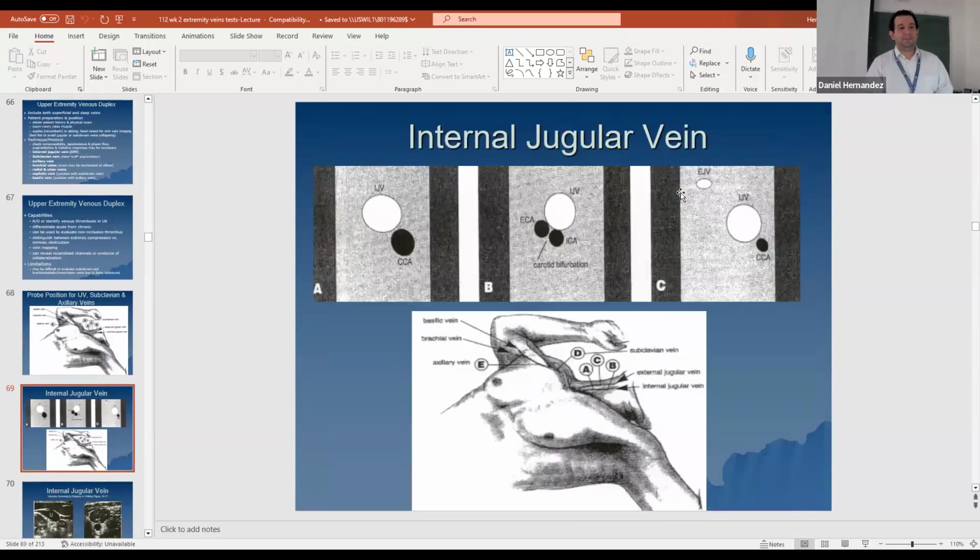So our jugular vein. We've practiced imaging the jugular vein here in lab. Again, the jugular vein sits anterior, or above, the carotid arteries. So you can see the jugular vein and common carotid artery. Coming more superior, the common carotid artery bifurcates, or splits, into internal and external, but we still have our jugular vein. Coming more inferior, we can potentially visualize the external jugular vein in that image as well.